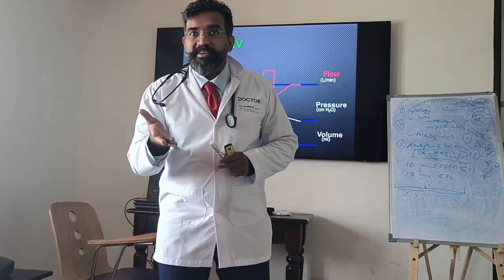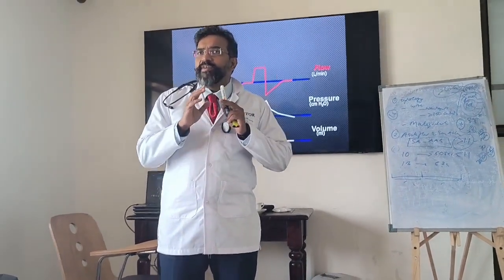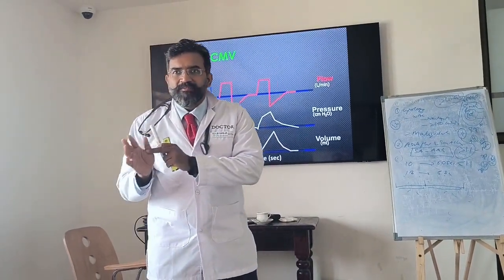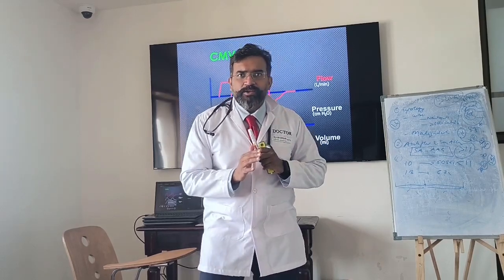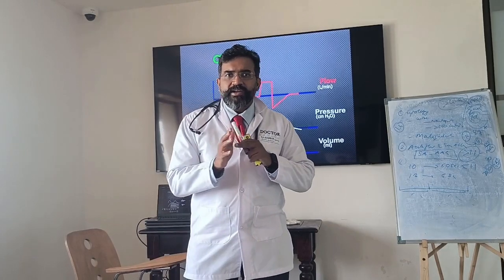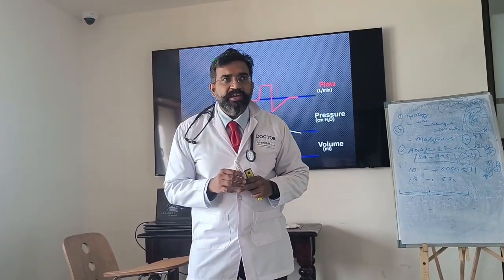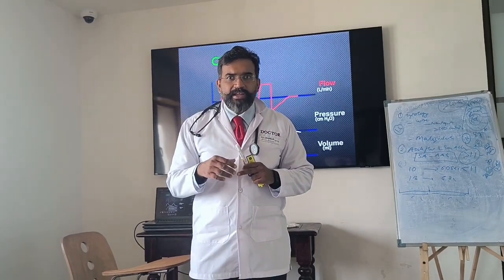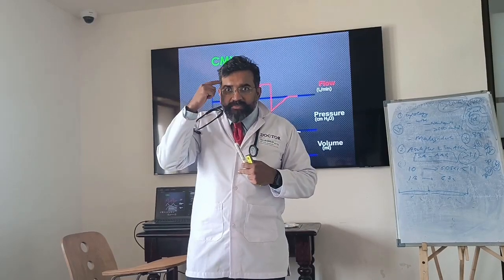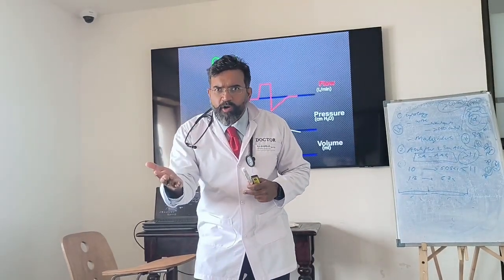It becomes ineffective. What are you normally trying to do? What did we start by saying? We are trying to get the ventilator as close as possible to the physiology. This means if the patient takes a breath, the ventilator gives the breath. It is coordinating with the patient's brain. The patient took a breath, so give it to him. We want the ventilator to do that.